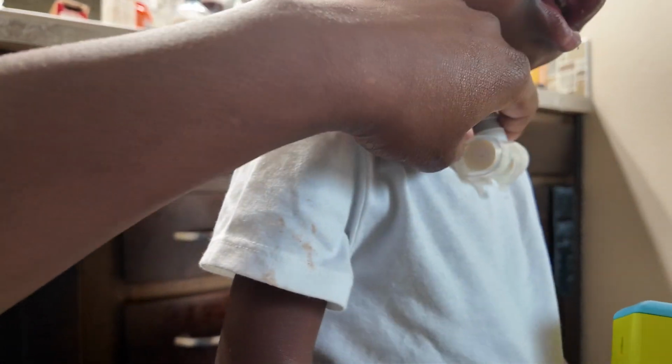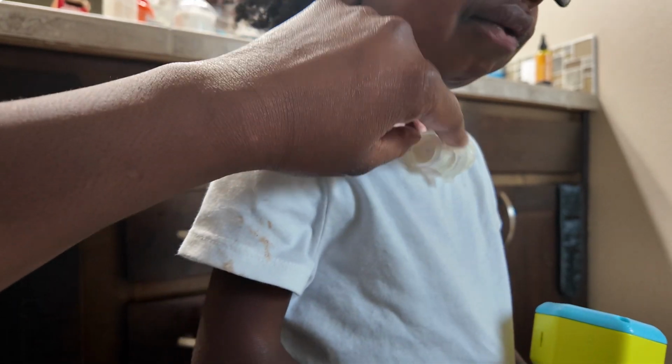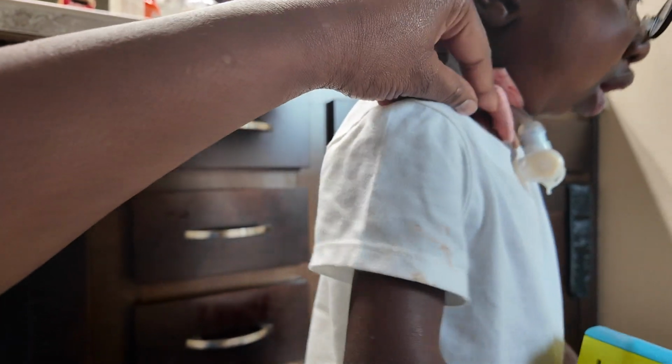Okay, so you guys, just so you can see before, we are going to change out this dressing and the ties. We are not doing a trach change where we take out the whole trach. We are just changing the dressing and the ties. It's an open area. It's an open wound pretty much. So the stoma has been open, and there's an incision there that's been open for her airway. But at the end of the day, it can get infected. There's so many things. So we need to make sure that we're clean and having good hygiene around her stoma.